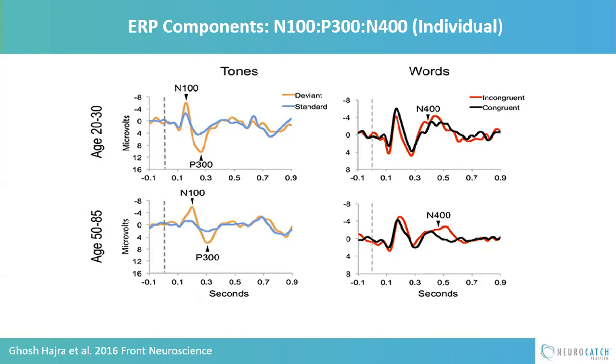And now we can look at the individuals in the N400. And again, look at the top right-hand waveform. Here, you see very clearly 2 bumps in this peak. We call this a bifurcated peak. In both, you see that it's much broader, and that's because it's reflecting a complex underlying process.